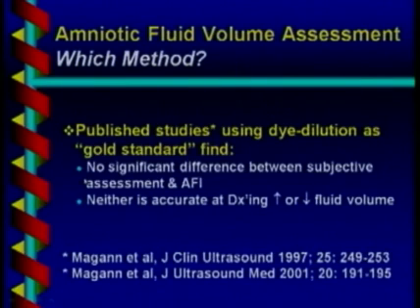So which method should you use? Well, there have been a couple of published studies that have used dye-dilution as the gold standard, and then compared the gold standard to subjective assessment or amniotic fluid index. What these studies have found is that there's really no significant difference between subjective assessment and amniotic fluid index when you compare them to the gold standard.